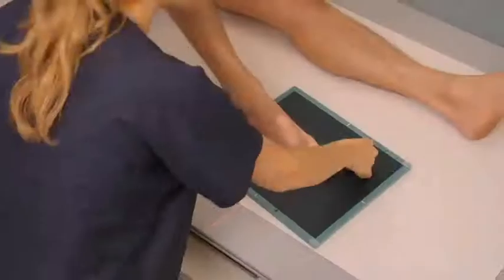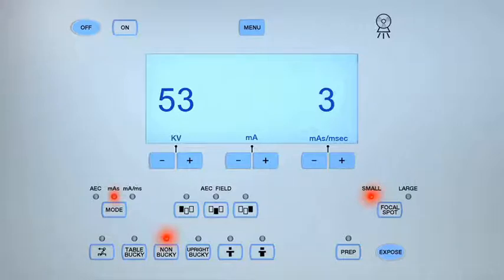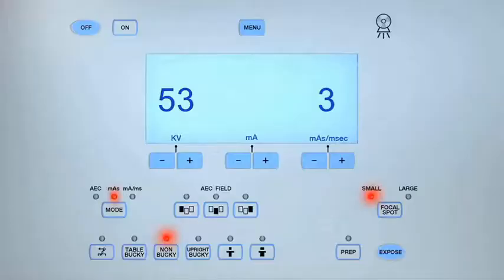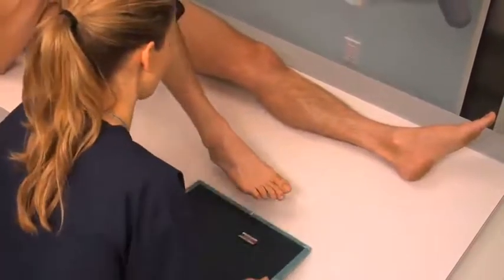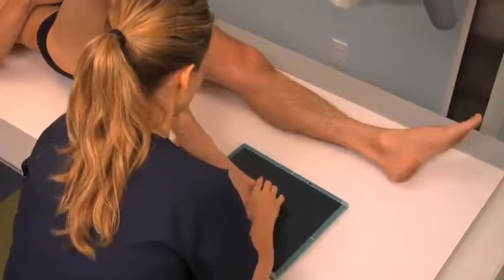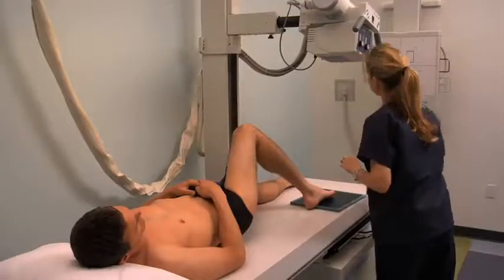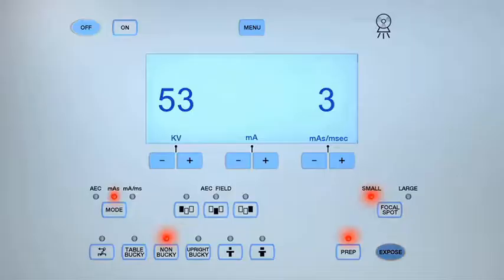Place the appropriate lead marker within the field of collimation. Move behind the protective lead barrier, adjust the exposure factors as necessary, and ask the patient to keep still. Expose the cassette by pressing the prep button, then press the exposure button. Once the exposure is completed, inform the patient that they may relax. Remove the cassette, insert it into the image plate reader, and proceed to the next projection. In an AP oblique projection of the first toe, rotate the patient's leg and foot medially and align their toe with the center of the cassette. Set the central ray to the first metatarsophalangeal joint. Expose the cassette and process.